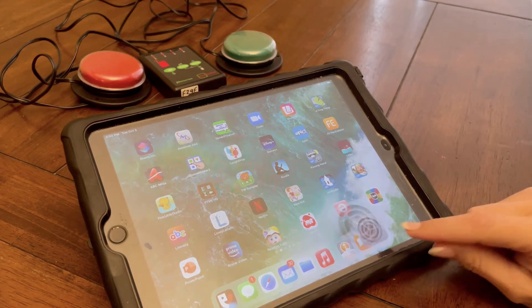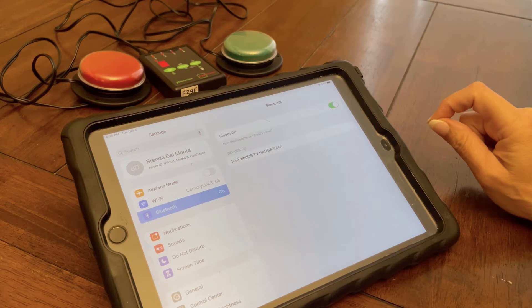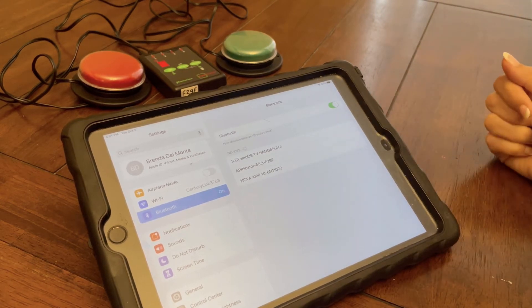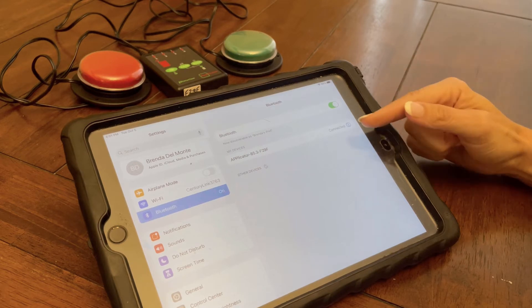So I'm going to go into the settings. I'm going to turn on my Bluetooth and pair it with my interface when it shows up. And now I'm connected.